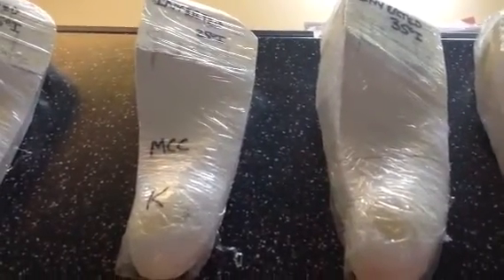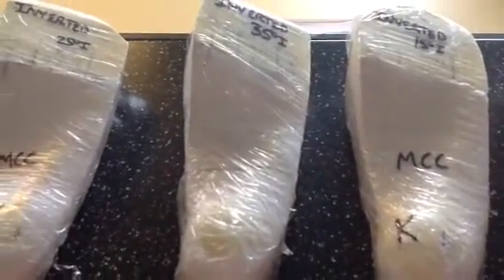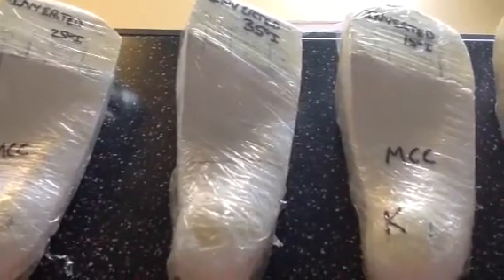Medial column corrections can be uncomfortable. I love them with high-arch feet because I don't think we ever support high-arch feet enough. With lower-arch feet, I prefer the more natural inversion produced with a straight inverted orthotic technique.